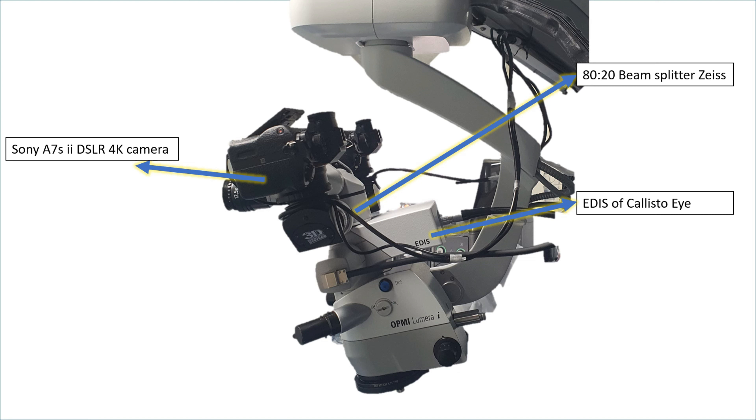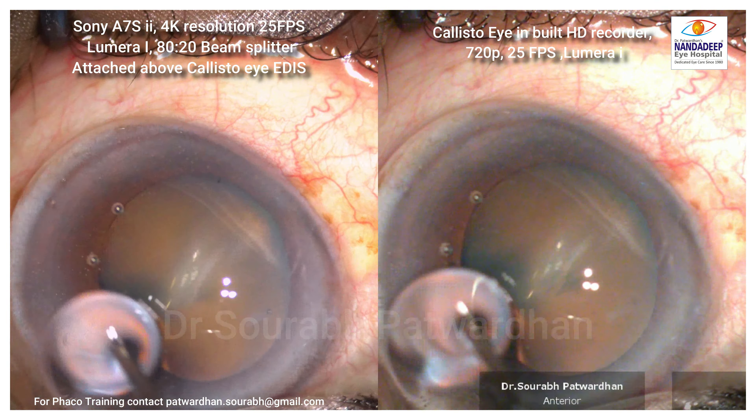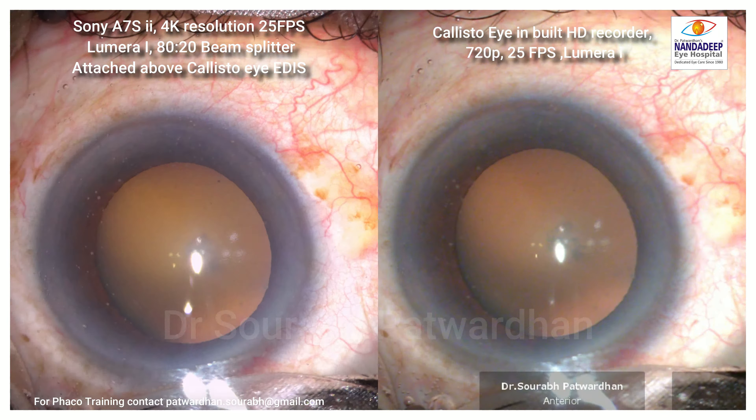I tried to match the contrast and colors of both cameras to have a good comparison. On the left side there is 4K at 25 frames per second with the Sony A7S2 camera. On the right side it is the Calistoi inbuilt HD recorder which records at a maximum of 720p.